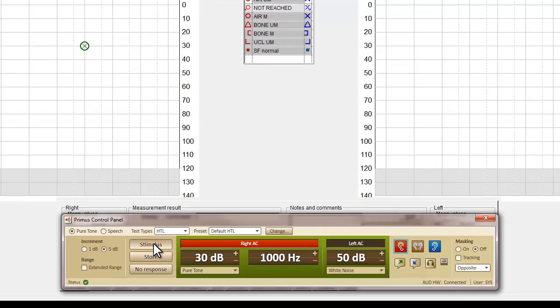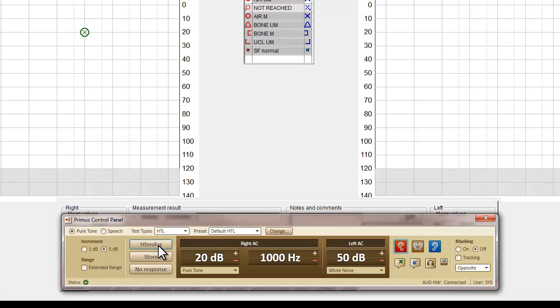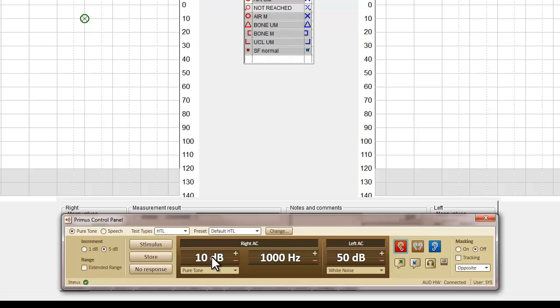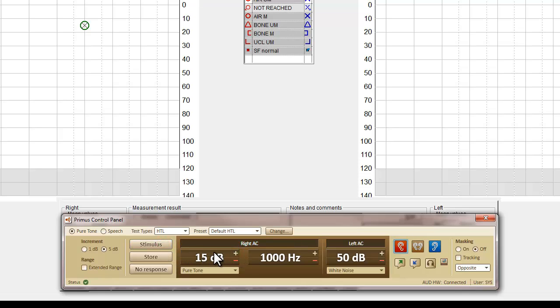In this demonstration, the stimulus is being presented by using the mouse to click on the stimulus button. Should you wish, the settings can be changed to allow the presentation of the stimulus by just hovering over the button. This will ensure the client is responding to the tone heard rather than the click of the mouse.